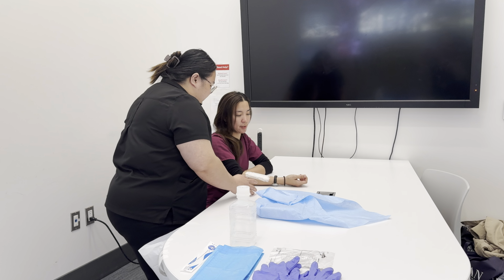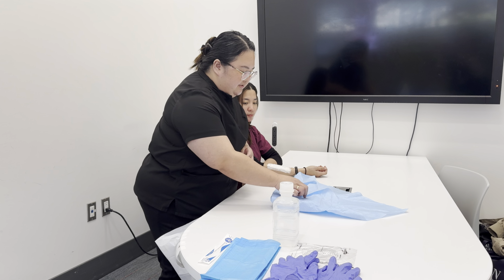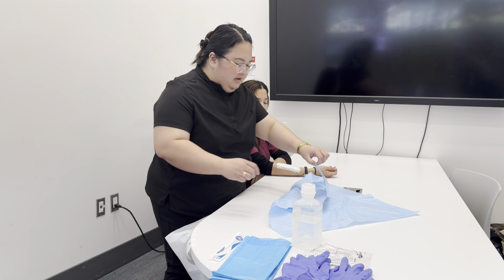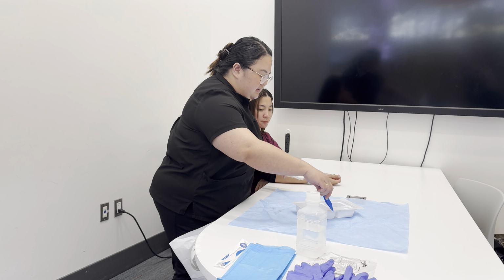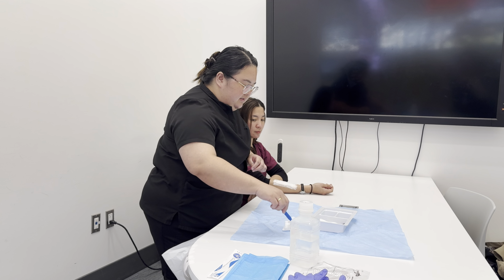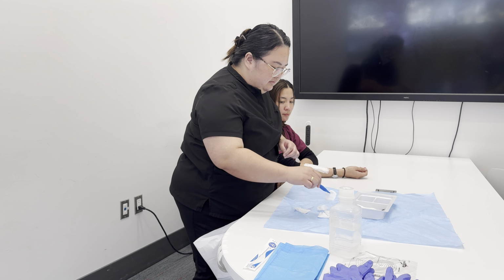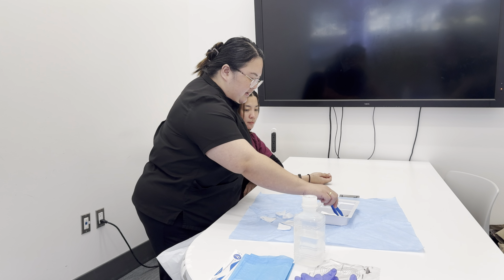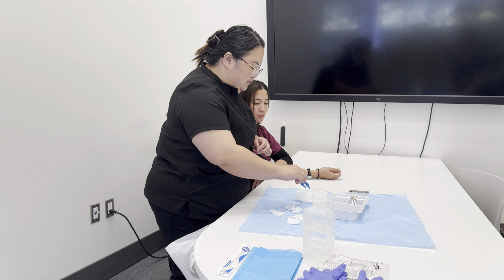Can you please move slightly? Turn on the side, and the other side, still maintaining the sterility by the 1-inch border. And grab the forceps, the sterile forceps, then reposition the kit. Then segregate the 6 small gauzes: 4, 5, and 6. Then the 2 metal forceps, and then the 4x4 gauze.